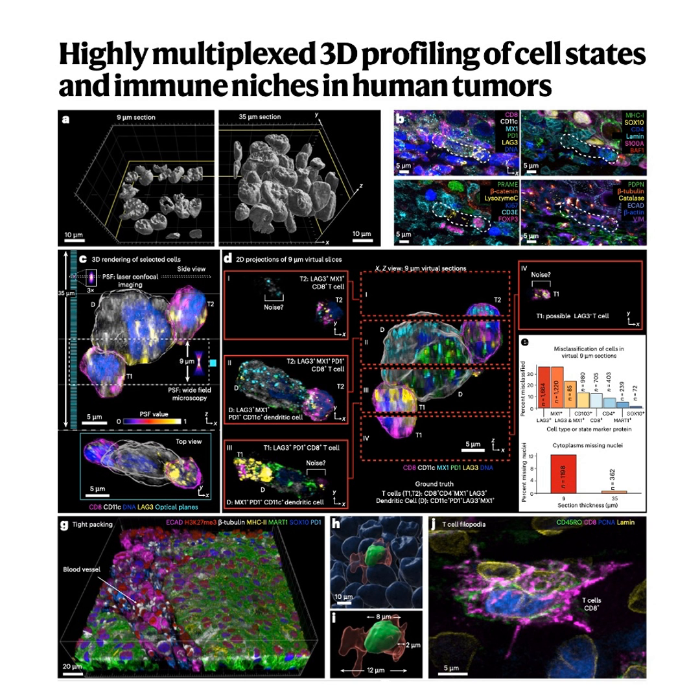The cells were basically the same shape, but at the margin they happened to be rotated about 90 degrees compared to how they were oriented deeper down. So in 2D, you were seeing them side-on versus end-on. Huh. So it's like looking at a cigar. End on, it looks round. Side on, it looks long. The cigar didn't change shape, just your viewpoint did.